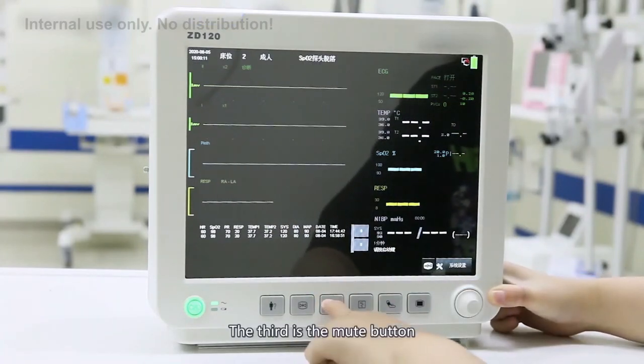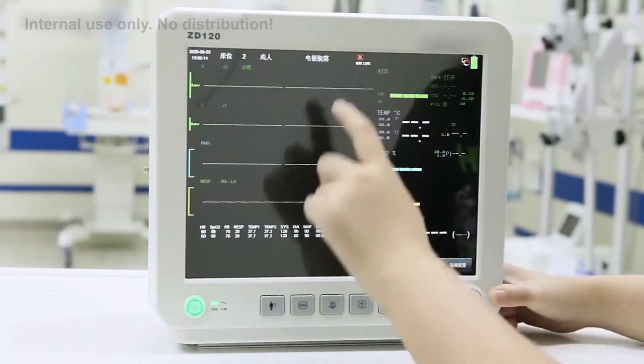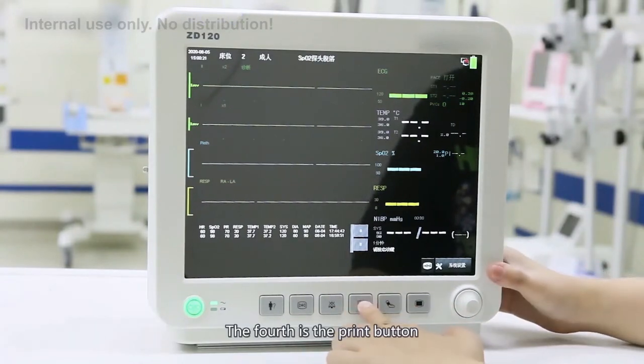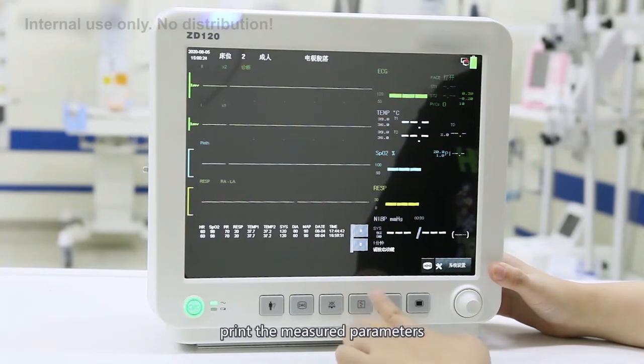The third is the mute button. When an alarm occurs, medical staff can choose to mute it. The default mute duration is 2 minutes, and it will be automatically cancelled after 2 minutes. The fourth is the print button. When the device is configured with a printer, pressing the print button will automatically print the measured parameters.